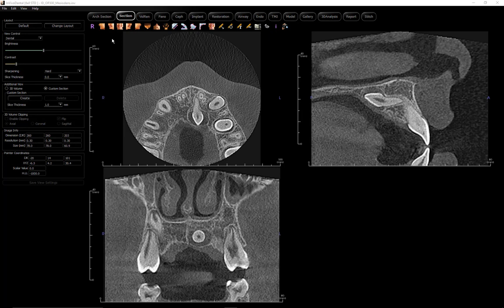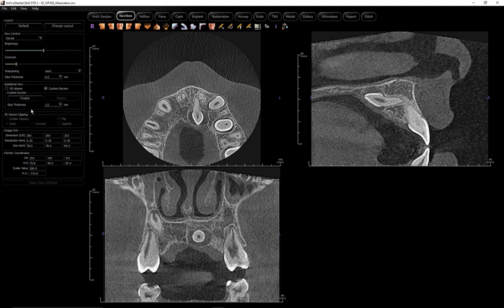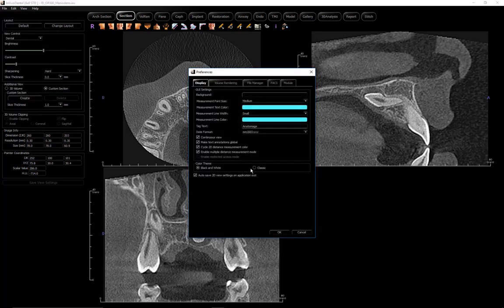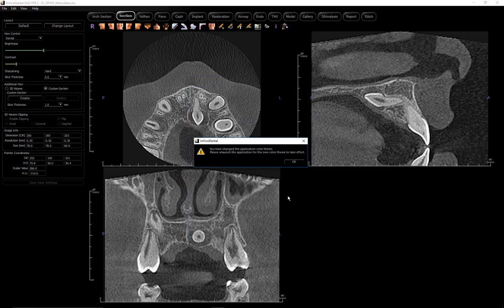While this setting may be preferred by some, there is still the availability of the classic view. This is easily changed by clicking on the File tab of the menu bar, then opening and making changes in the preferences.